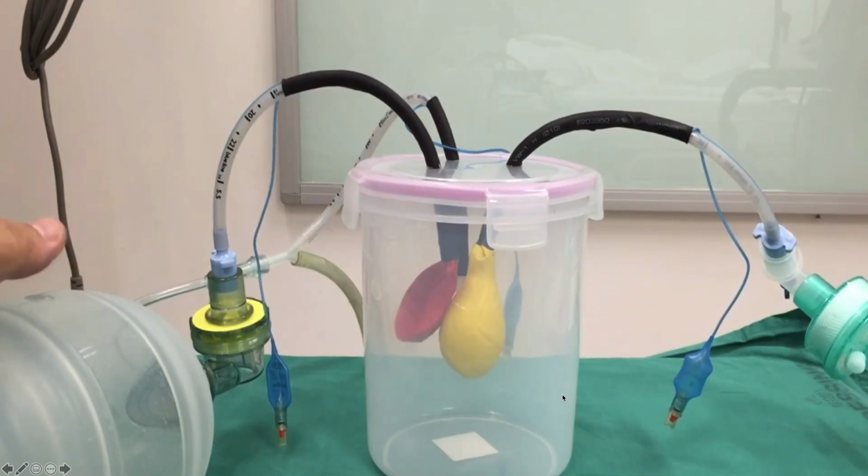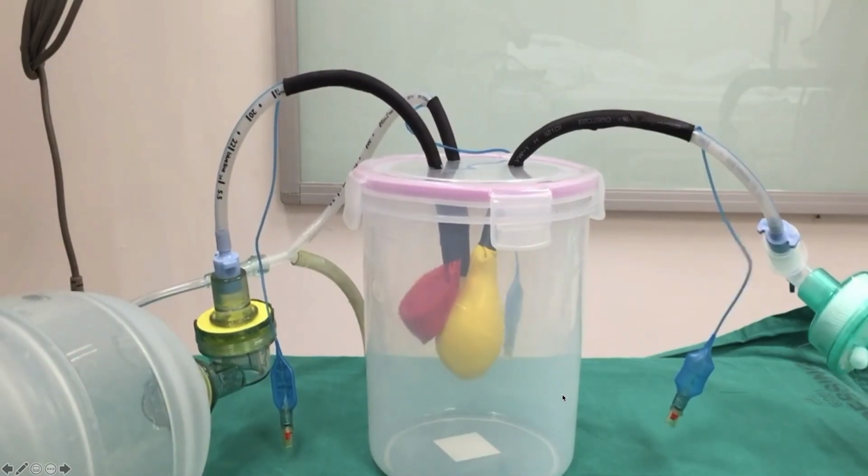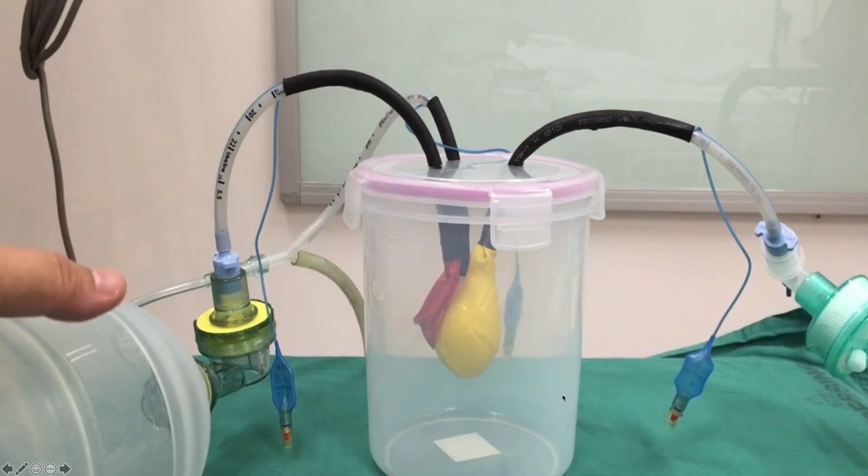So alveoli that pop open and collapse down over and over again while under mechanical ventilation, this can lead to long-term damage and troubles with oxygenation and fluid buildup. So this is where PEEP helps. One, it helps the alveoli stay open and therefore opening more easily, and also keeps the alveoli from completely collapsing down.